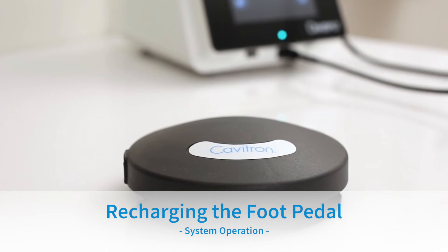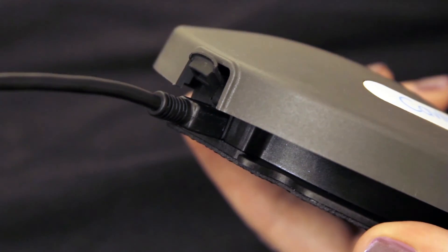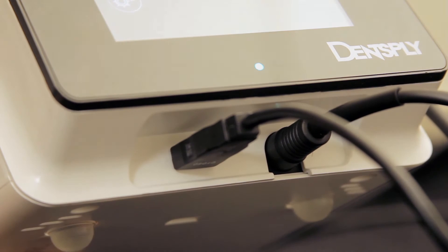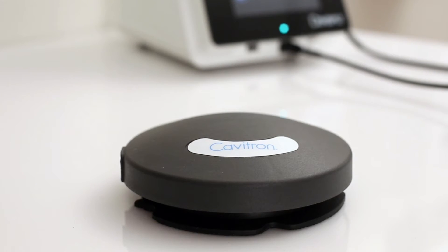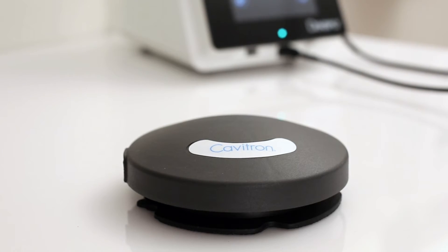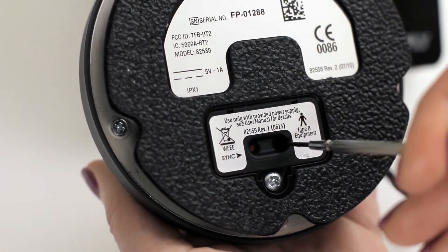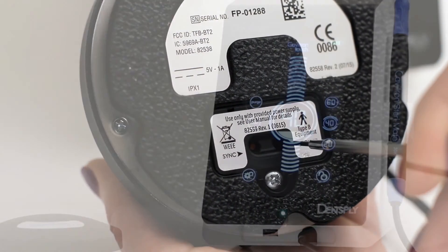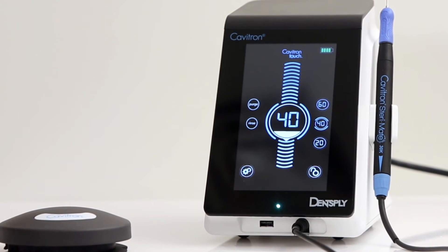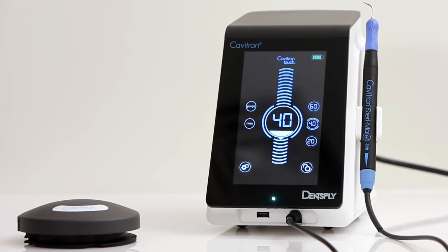Recharging the Tap-On Foot Pedal: With the unit powered on, plug the auxiliary foot pedal cable into the foot pedal and the USB port on the front of the unit. The foot pedal is packaged with the power off; the foot pedal must be turned on prior to use. The foot pedal will not charge in the off state. To turn on the foot pedal, press and hold the power button for 4 seconds. Allow the foot pedal to charge up to 4 hours to achieve a full battery charge, which will be visible by the battery charging icon that appears on the screen.